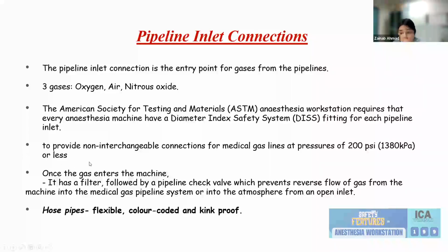Also, because the gas is coming from the pipeline, it has a filter to prevent any leakage or any particulate matter coming in.